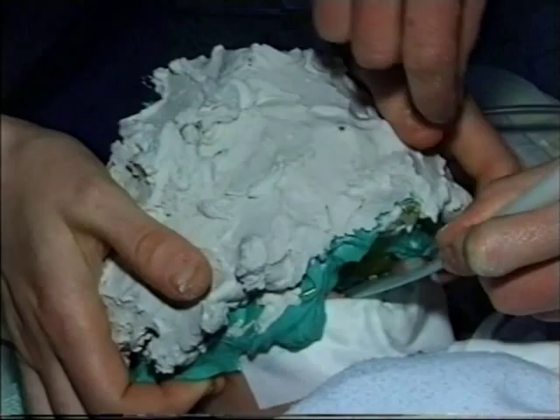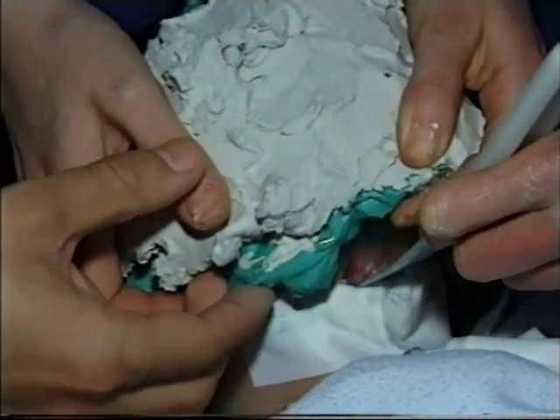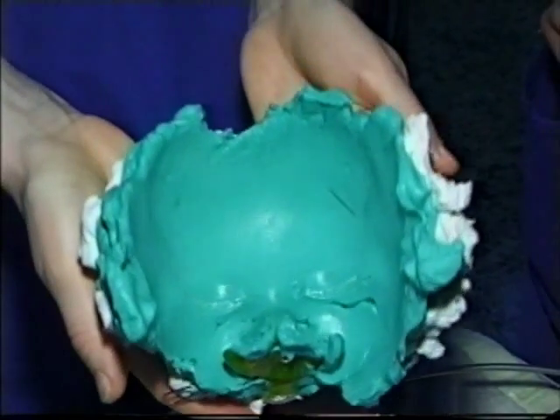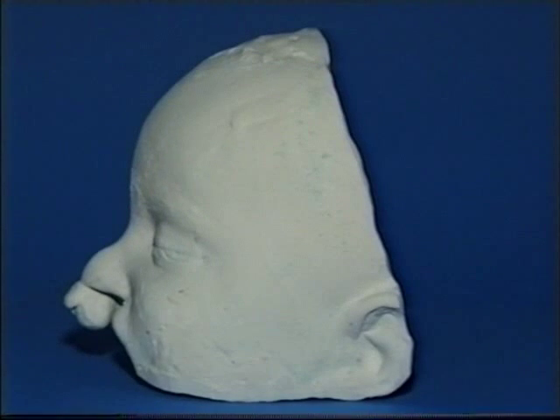Removal of the facial impression — here is the final impression and here is the final model of the face.